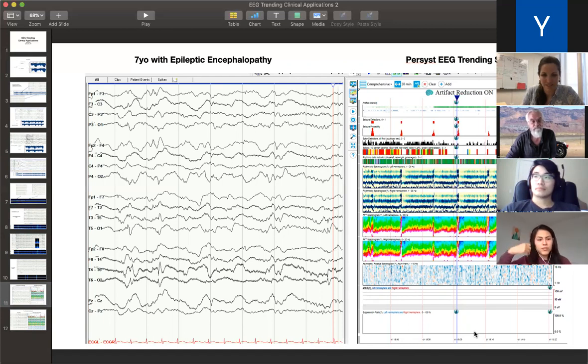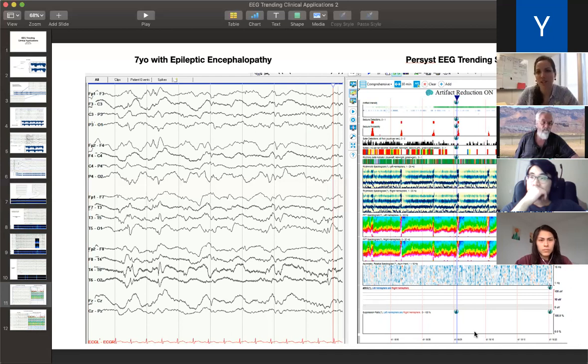Kind of a general question, because you talked a lot about the NICU and the babies. Just curious, do they do EEGs on only the babies that exhibit signs of seizures, or is it a routine thing that they do? Yeah, so it's a good question. We don't EEG every baby that comes through the NICU, but any baby with any kind of funny movement or episode usually gets an EEG.